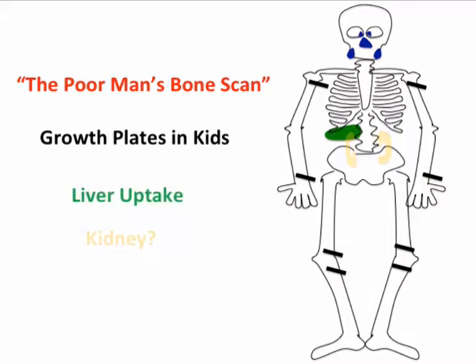What about kidneys? Is that okay? Sorta, but let's just say no. If you've got renal uptake after 24 hours, that's bad. Remember that gallium is like this nonspecific inflammation marker. So inflammation in the kidneys is abnormal.